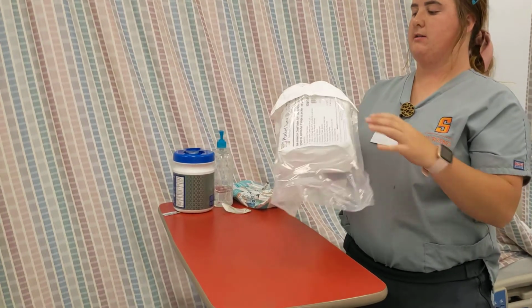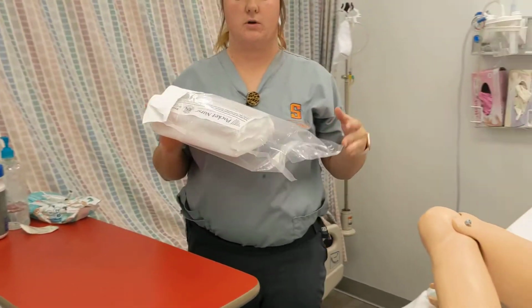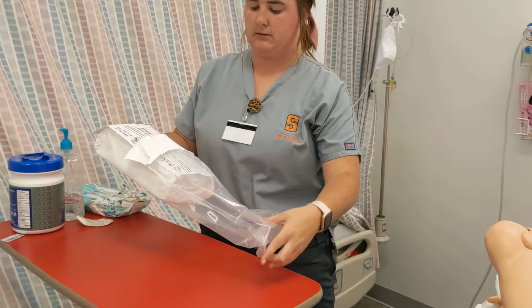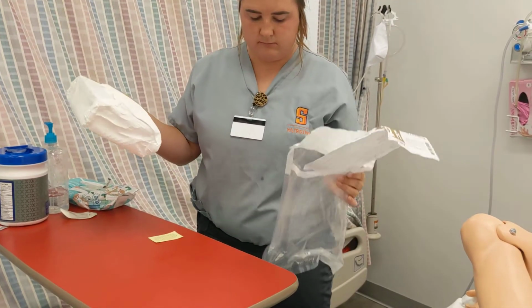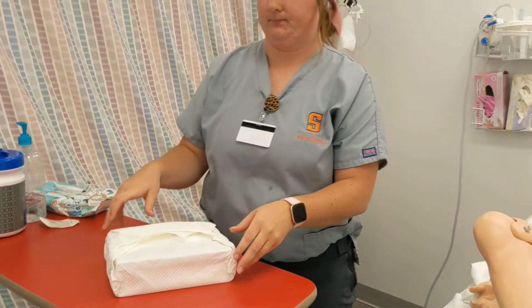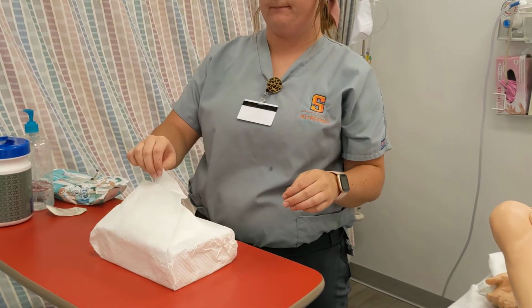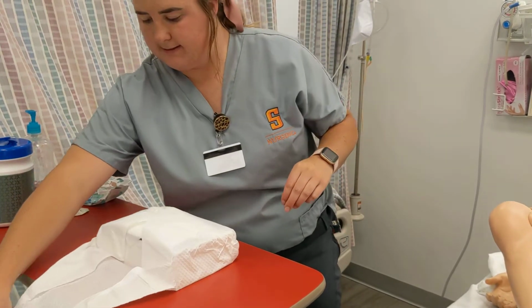Now that we're beginning this sterile procedure, I'll just make sure my hands stay up here at working height. Okay. All right, and we're gonna begin. I'm just gonna open this up.